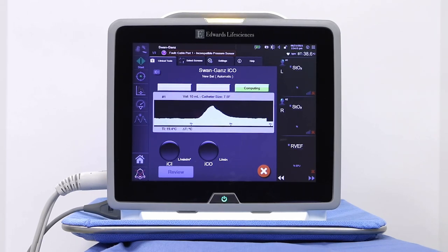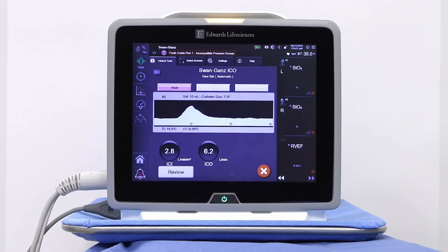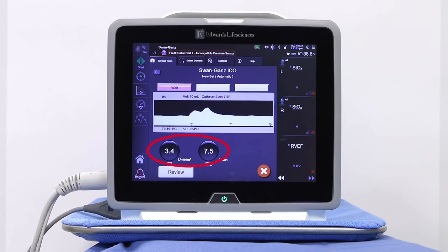Repeat this procedure up to six times as desired to obtain a sufficient number of readings to produce a good average value. The Hemisphere Advanced Monitoring Platform will automatically disregard readings for boluses deemed inadequate.